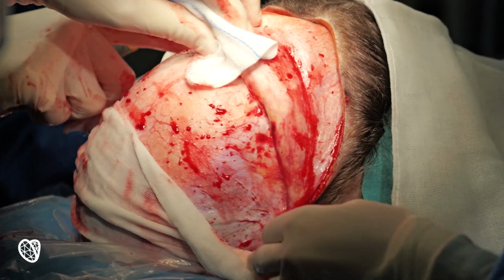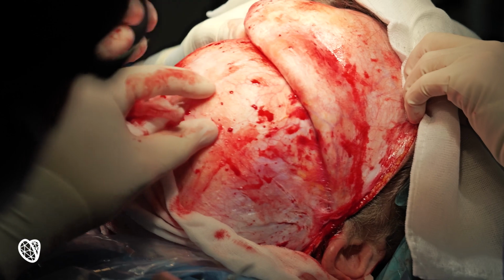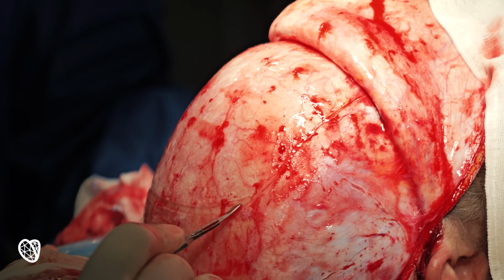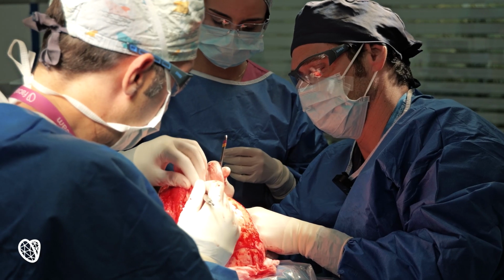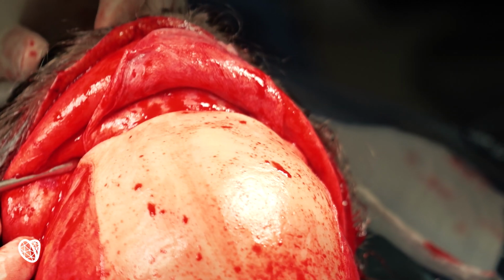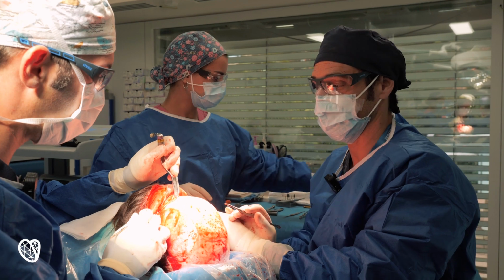Now that the whole flap has been raised up, we go to the second layer, the pericranial flap. It's a very extensive flap of the layer totally adapted to the bone. So now we are going to expose the bone. The whole region is now totally exposed, and we have identified the key areas, the frontomalar and nasal bones. So now we can start with the reconstruction.